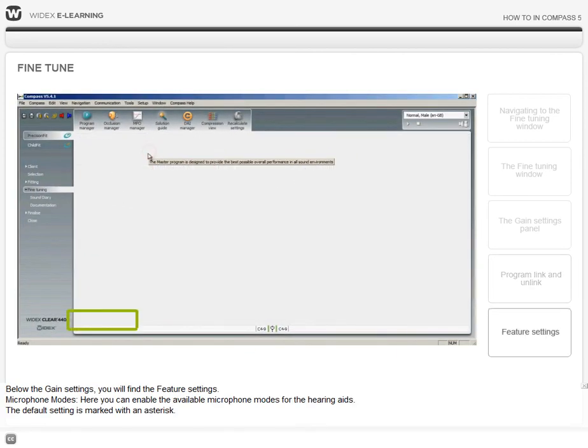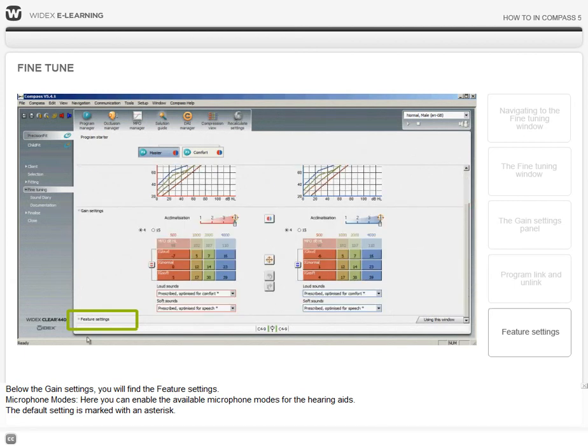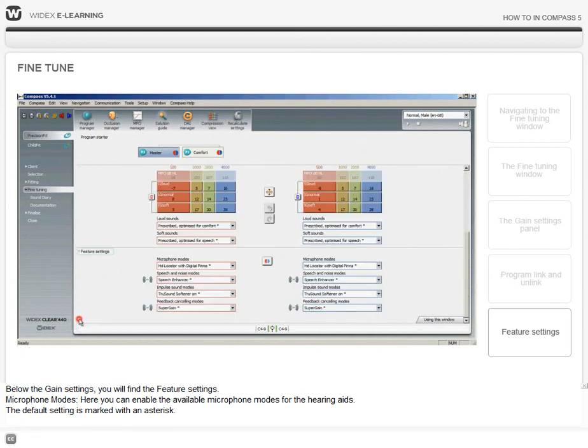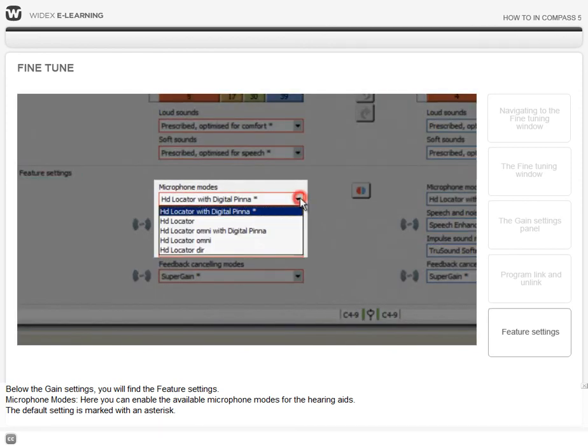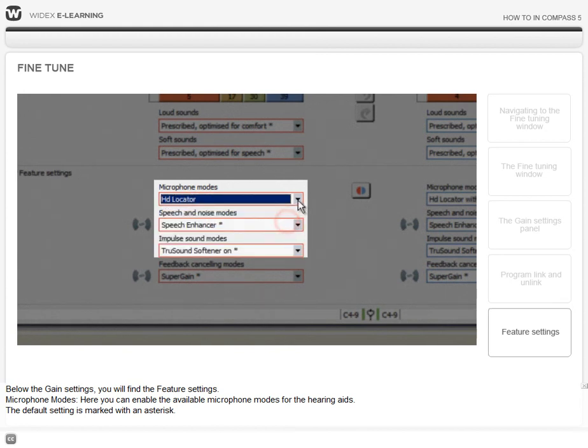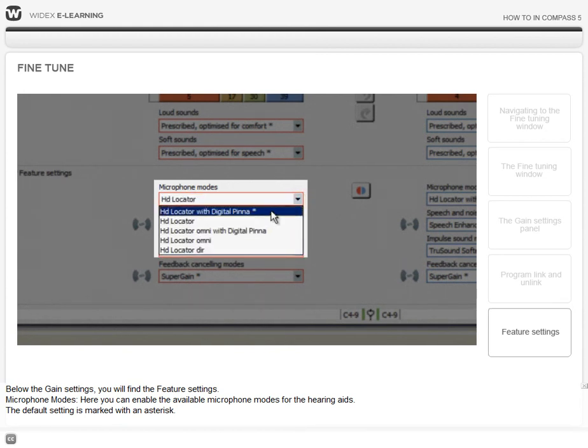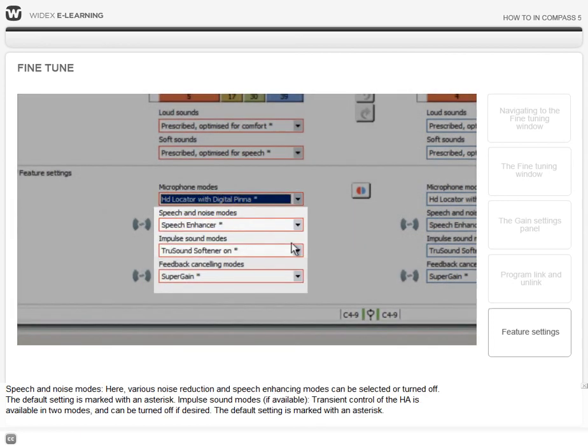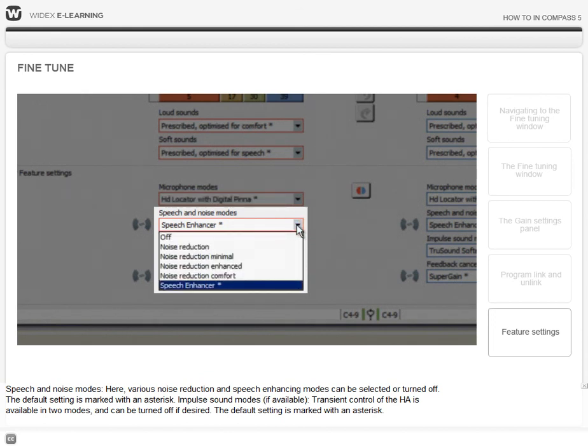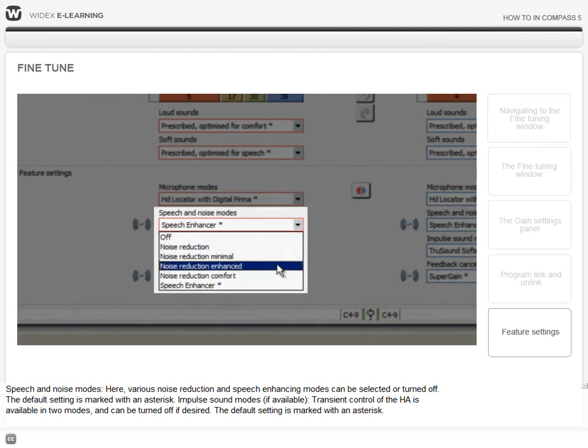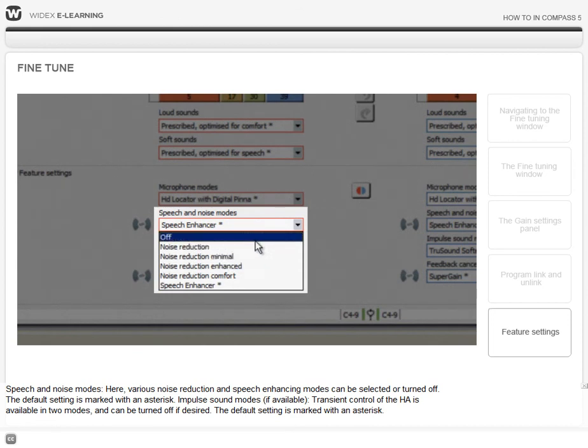Below the gain settings, you will find the feature settings. Microphone modes: here you can enable the available microphone modes for the hearing aids. The default setting is marked with an asterisk. Speech and noise modes: here, various noise reduction and speech enhancing modes can be selected or turned off. The default setting is marked with an asterisk.